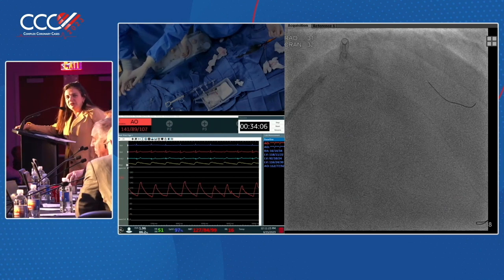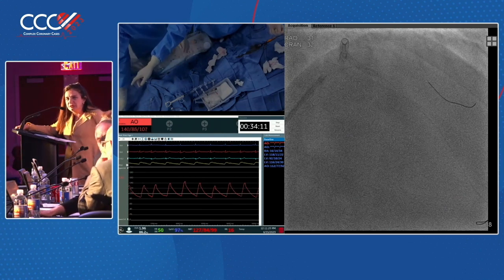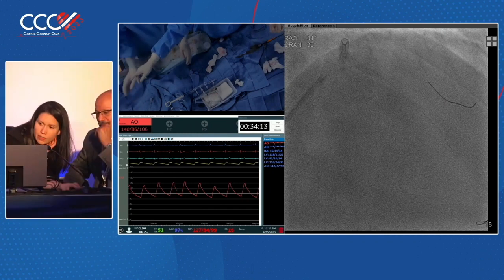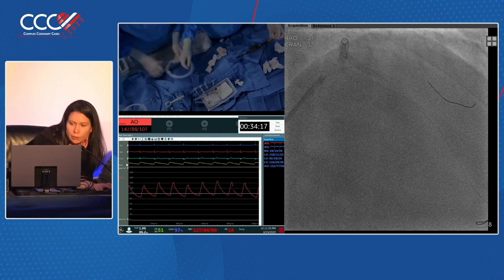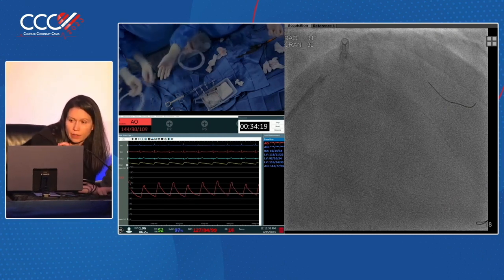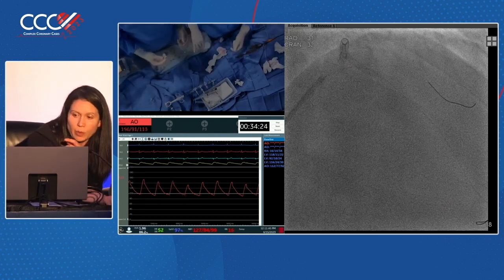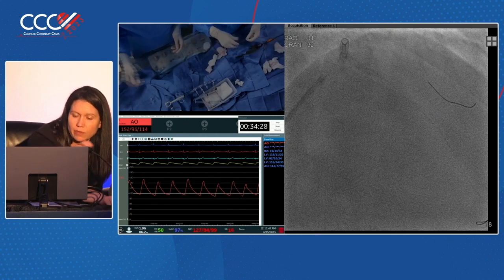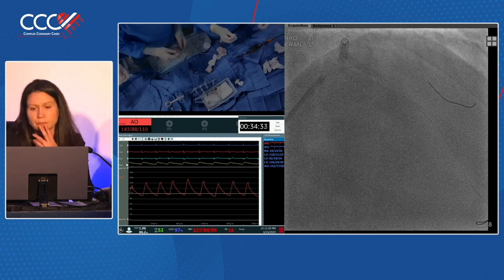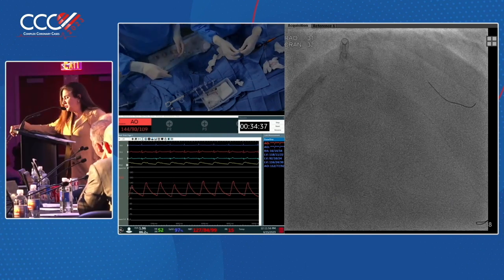Kate, do you think that's going to be the future? Is that what you might think about, or do you need to see clinical trial results? No, I think there's already so much uncertainty in these bifurcation lesions, and we're getting more comfortable leaving small dissections behind with DAPT, that with good flow, they will often stay open. So I think similarly, we're already trying to get away with this with the cutting balloon results. So DCB just makes me feel more confident that maybe we're helping reduce failure later. Great. Thank you.